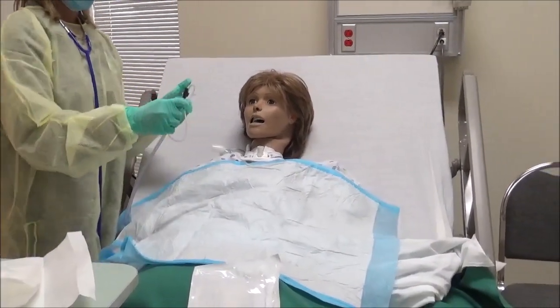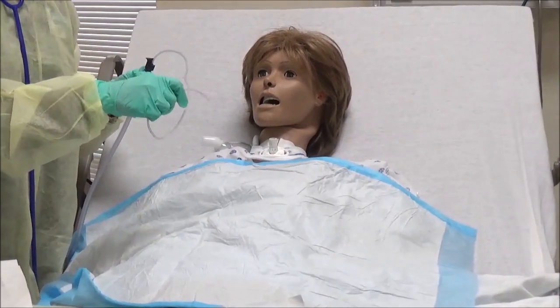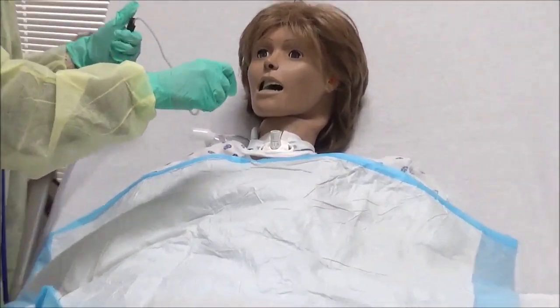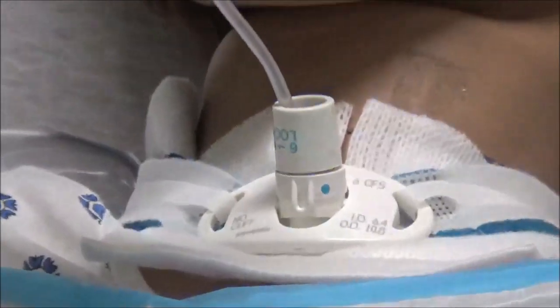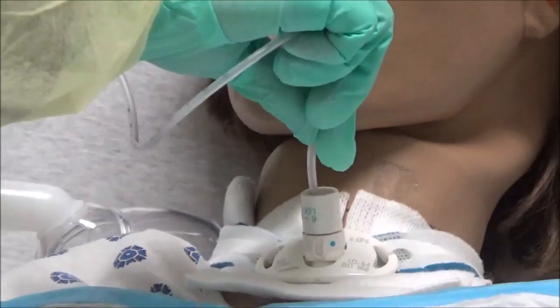I'm going to insert the catheter into the client's trach 4 to 6 inches until I meet resistance or the client coughs. So I insert the catheter 4 to 6 inches, making sure I don't contaminate anything until I meet resistance or the client coughs.